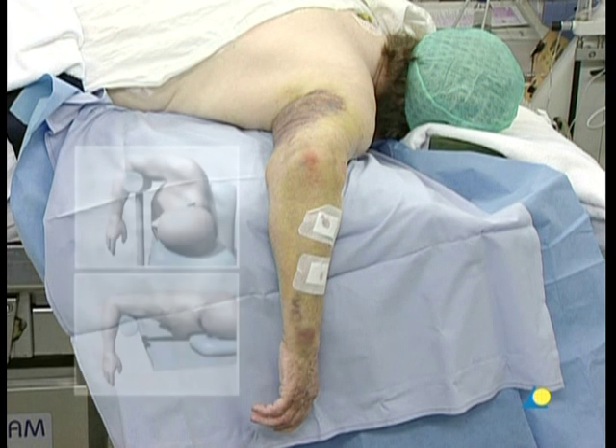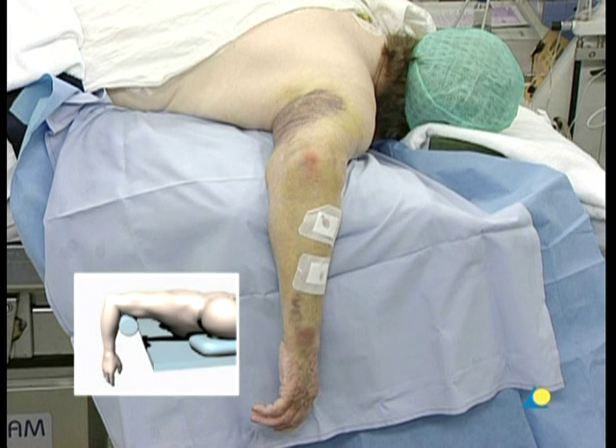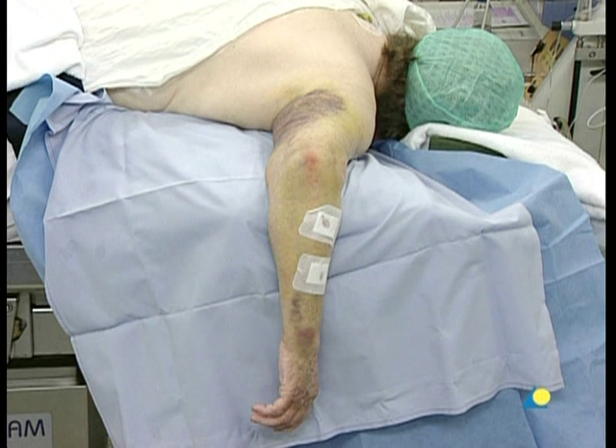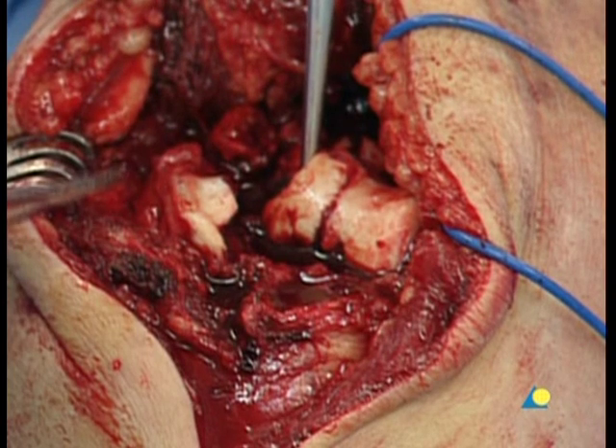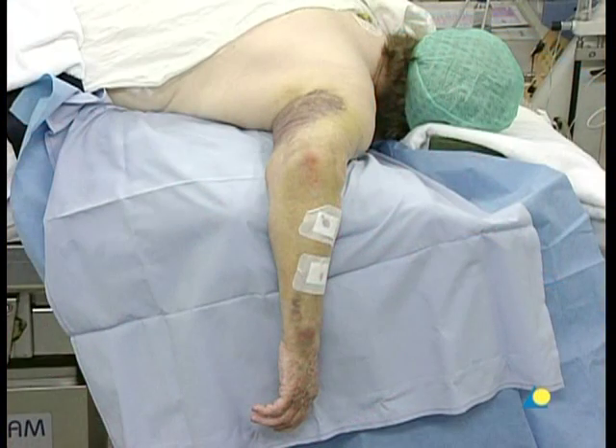the patient is placed either in a lateral or a prone position. The prone position is the favorite option; a short arm support is used so that the surgeon may sit. Care must be taken to ensure that the elbow can be flexed at least to an angle of between 110 and 120 degrees. If bone graft is needed, a donor site should be prepared. A sterile tourniquet applied sufficiently proximal is recommended; however, it should be inflated only if needed to control any major bleeding. In this case, a tourniquet was not used.